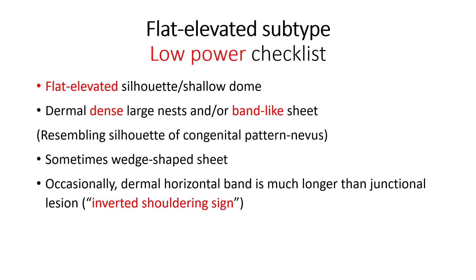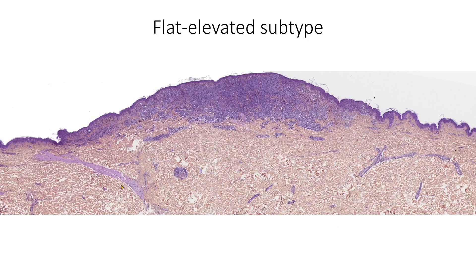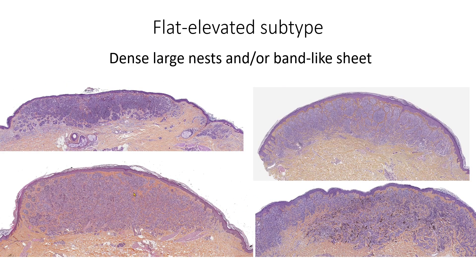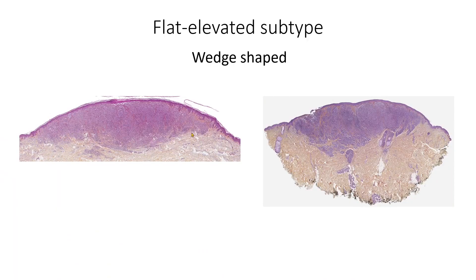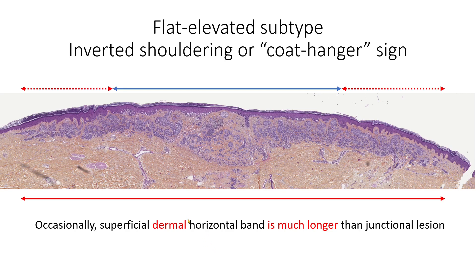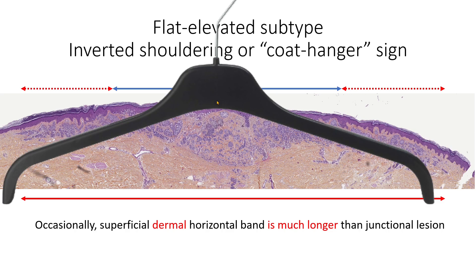Moving to the flat elevated subtype, here is the low power checklist. A typical example shows this flat elevated architecture, always with high density — the upper dermis is made of nests and sheets that are more coalescent. Lesions that go deeper can have a more wedge-shaped architecture. Another key element is what we call the inverted shouldering or coat hanger sign: the dermal expansion goes much further on the sides than where the junctional component stops. This inverted shouldering or coat hanger sign should always raise suspicion for nevoid melanoma.